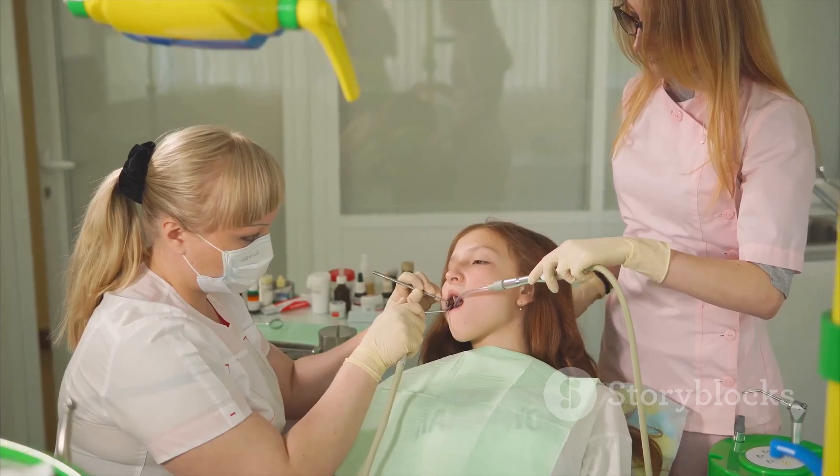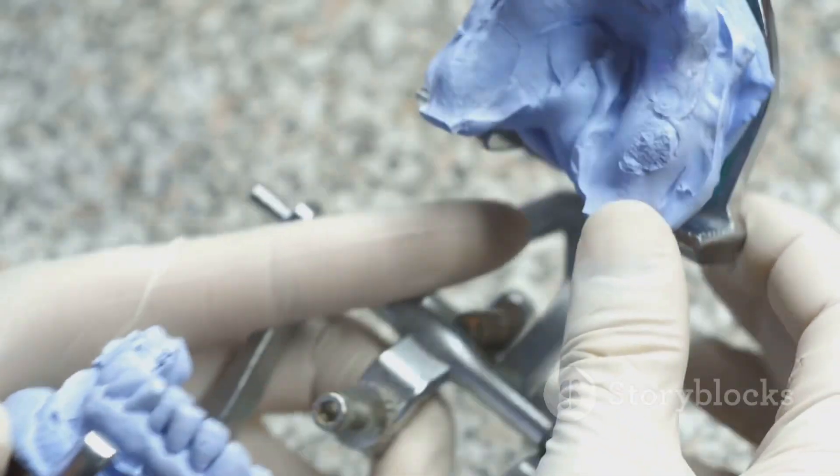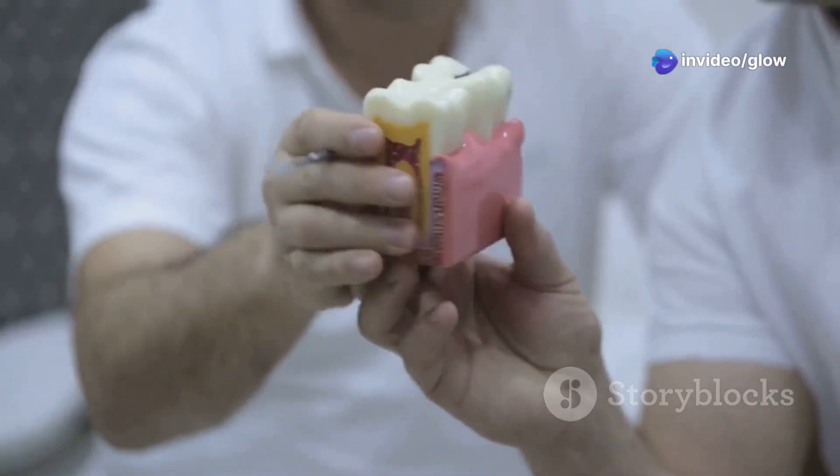Next is retention form — this step keeps the filling locked in place. For amalgam, undercuts in the walls work wonders. For composite, bonding agents do the trick. Sometimes dovetail extensions might be the hero you need.